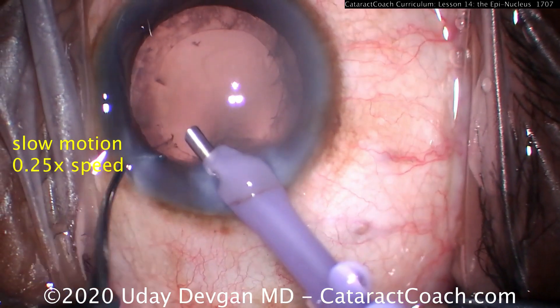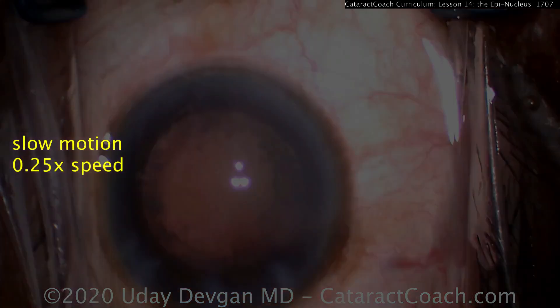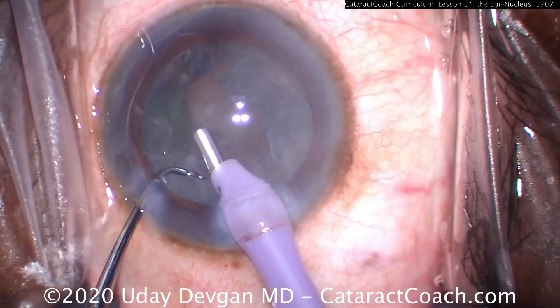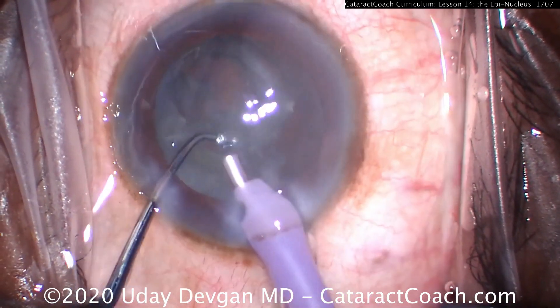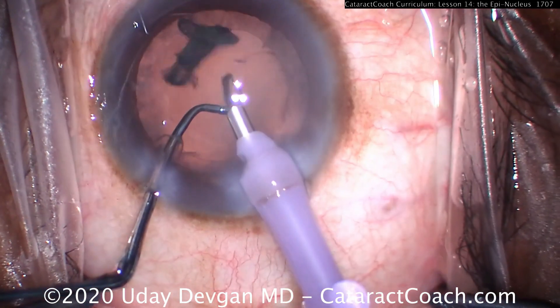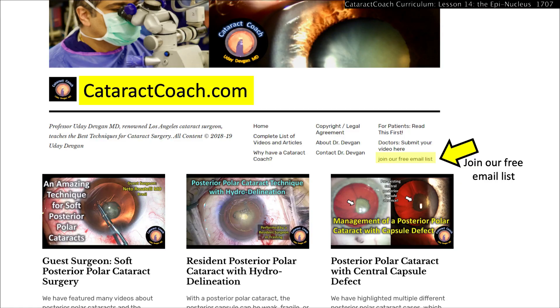Grabbing the distal end of the shell with vacuum, using the chopper to flip it upside down. Let's watch one more time in real time: last nuclear piece coming out — and now using just vacuum, trying to grab the distal end of the epinuclear shell. There it is. Chopper now pushing it forwards to flip it upside down, and now we can emulsify it and finish the case quite easily. I hope you found that useful. Please check out CataractCoach.com, our free website — you'll learn everything you want about cataract surgery. Sign up for the free email and we'll send you a brand new case every morning.